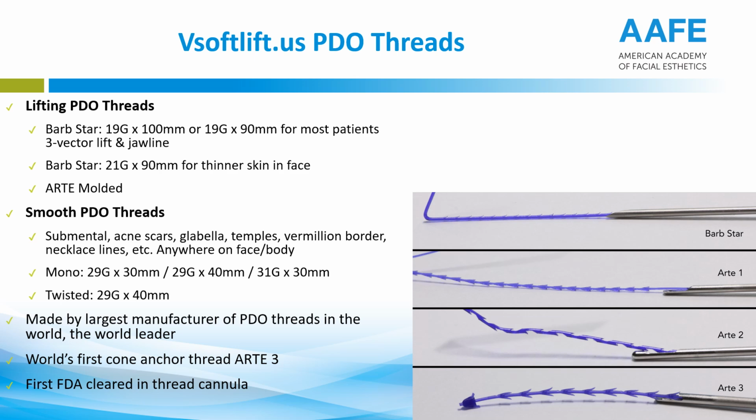The molded threads are even stronger than that, and they come in different sizes, shapes, and thread designs, depending on whether you have thin, medium, or heavy tissue. For heavy tissue, you're going to want that anchor thread on the bottom there, which is a 17 gauge, one of the thickest ones out there. Thick is not always good, but it is good in certain cases here.